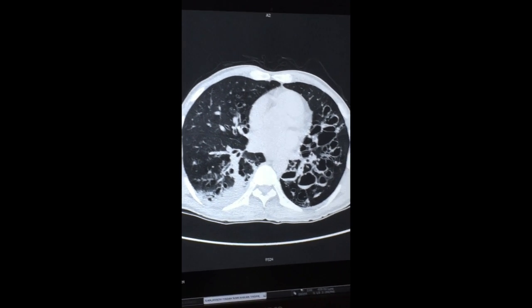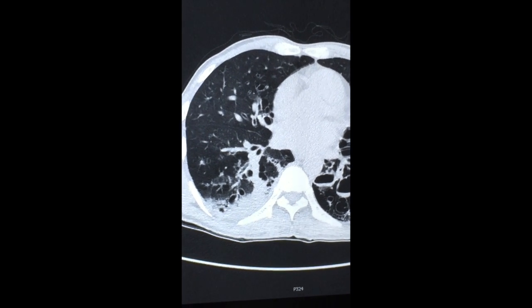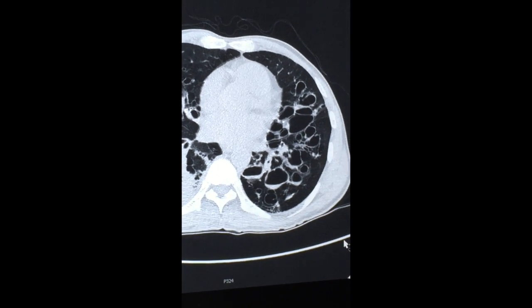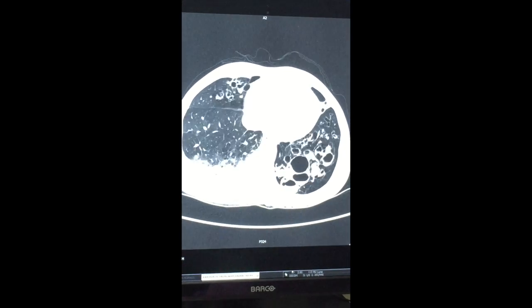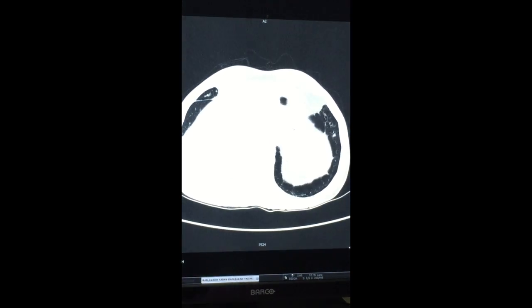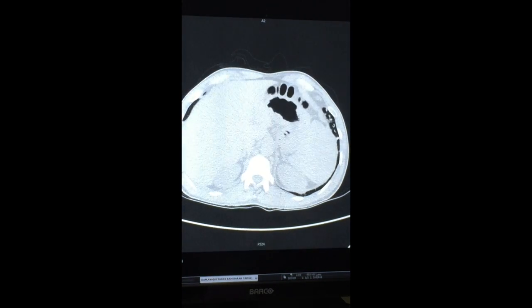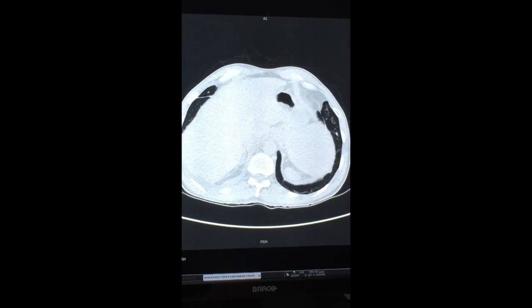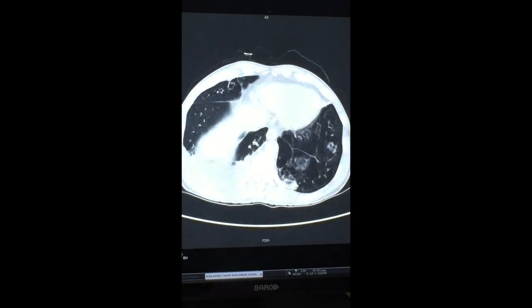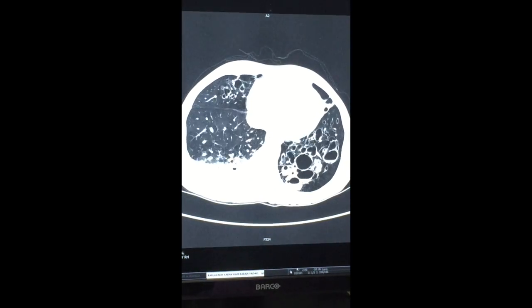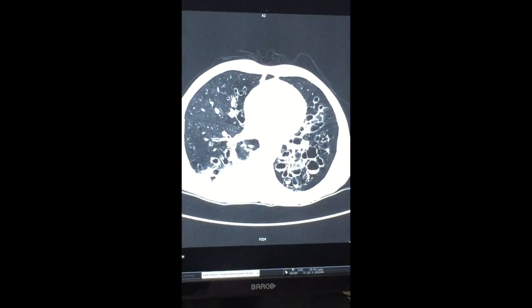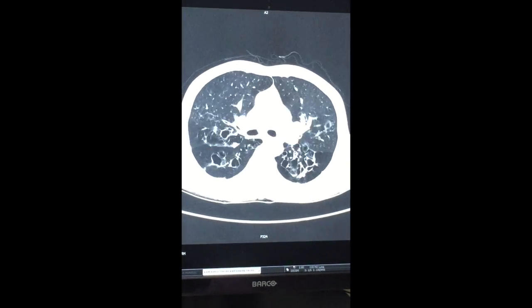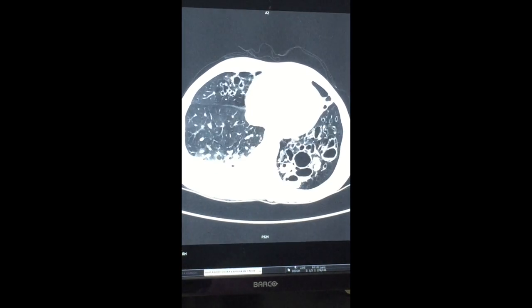It was a case of a 48-year-old male. A CT scan was done and it was diagnosed as bronchiectasis. Bronchiectasis is defined as irreversible dilatation of the airway due to destruction of airways caused by repetitive infection.